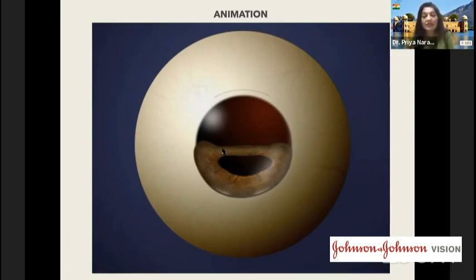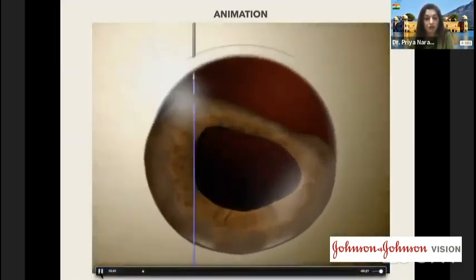What we need is a double arm suture for this. This is just for beginners who are venturing into iris repair techniques, that you need a double arm for doing an iridodialysis repair with a non-oppositional technique. So I'll just run through this video here.